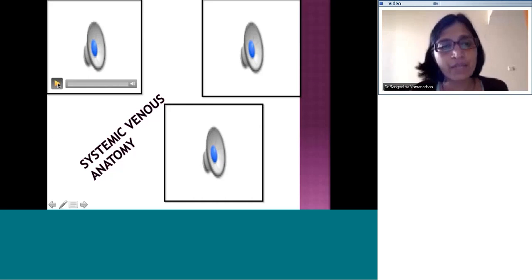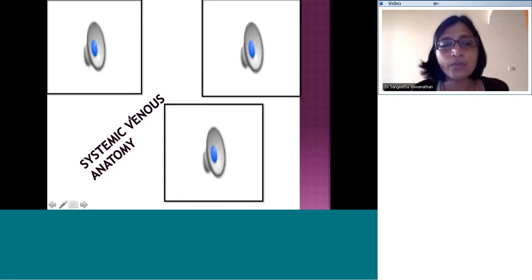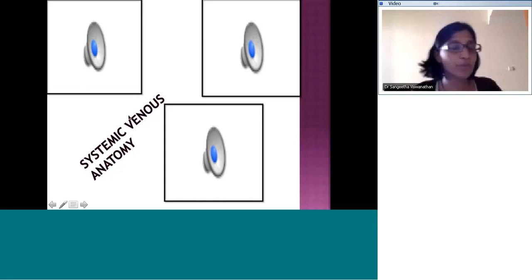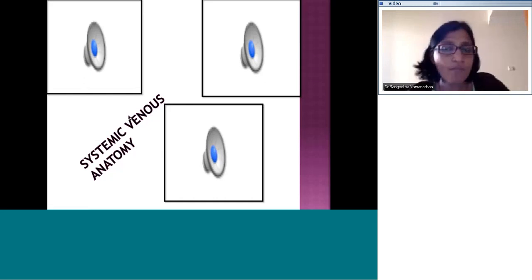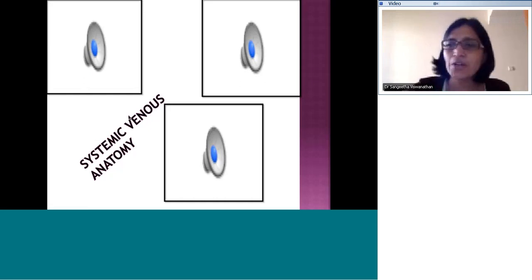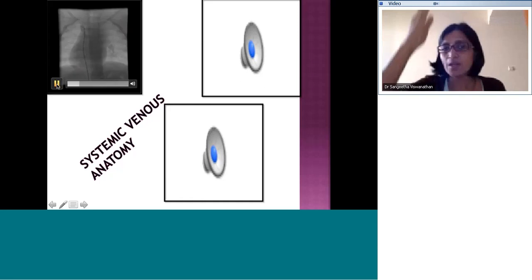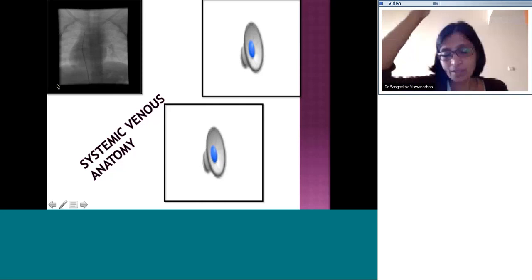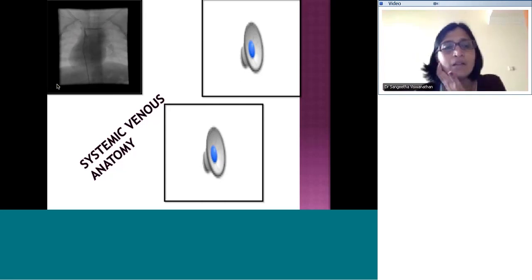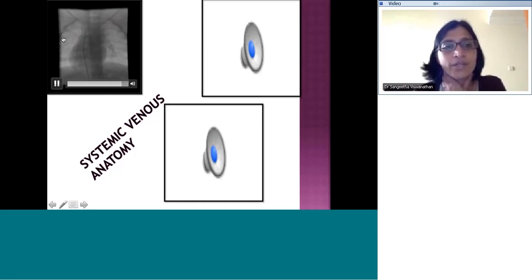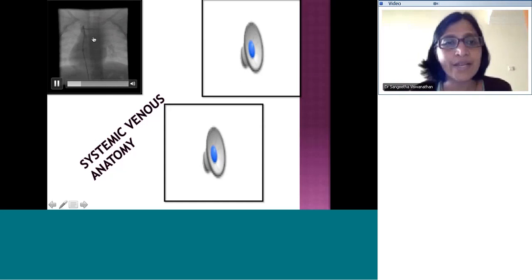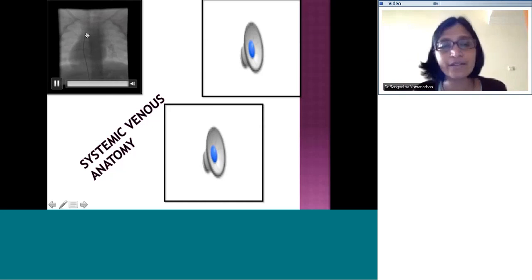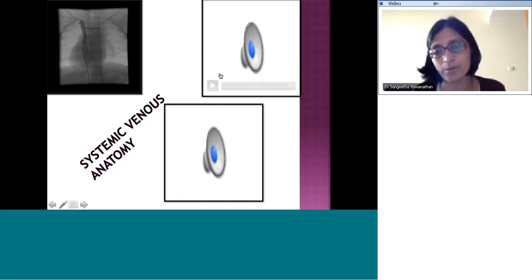Next we move on to systemic venous anatomy. For systemic venous anatomy the best view is once again the frontal plane, because the SVC and IVC run along the spine and are best seen using the frontal view. This angiogram — we've already seen this patient with dextrocardia and situs solitus — shows an injection into the right-sided SVC. You can see the SVC clearly demonstrated; there's a small interconnecting vein visible and a left-sided SVC appears to be present.